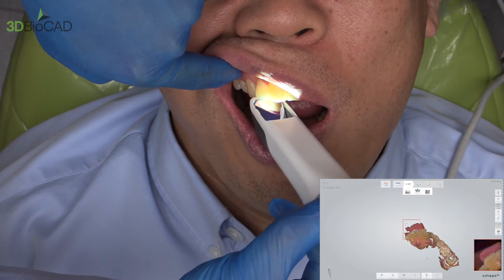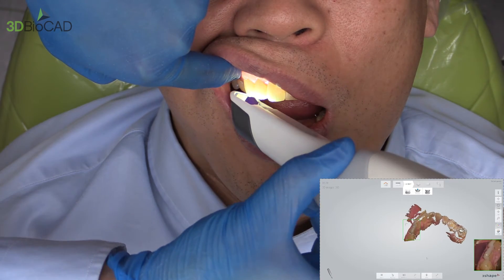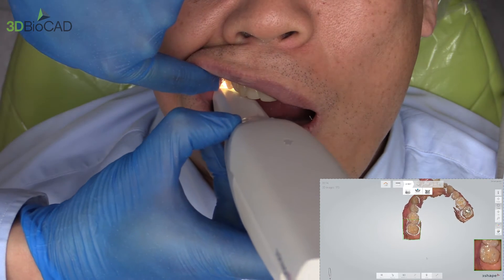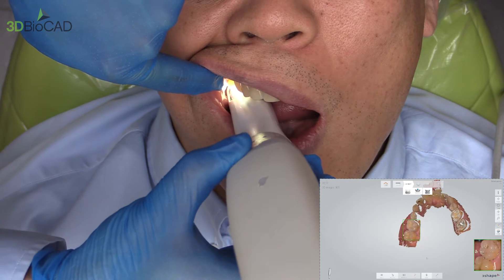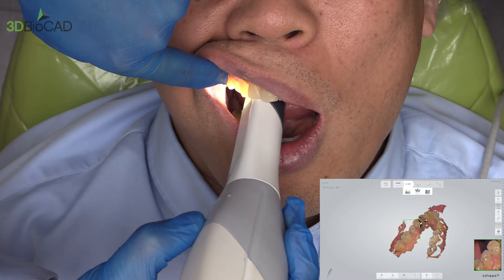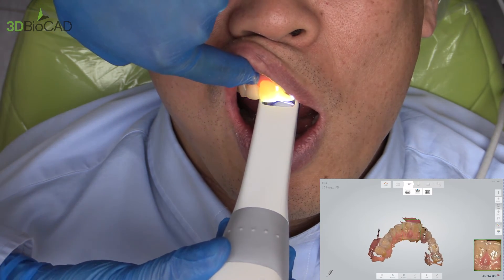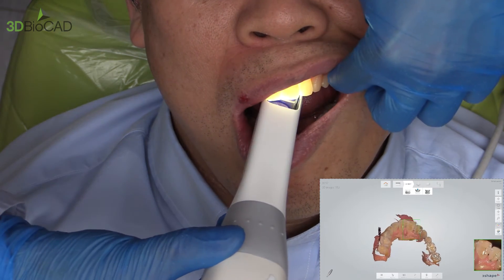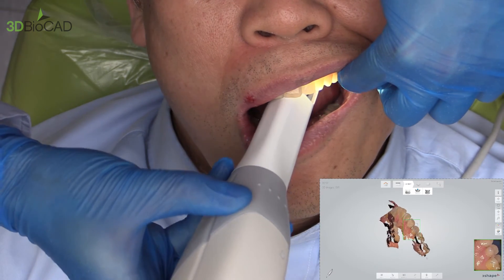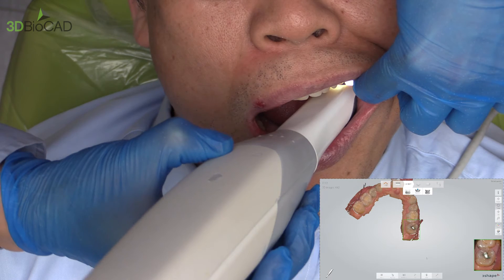Make sure here you want to scan a little bit of facial, just giving the computer a reference to put pictures together when you're scanning the facial later on. Rotate to the lingual side. I look in the patient's mouth and I try to listen to the sound. As you get better with the scanning procedure, it's like driving — the road is your main thing to look at, but sometimes the screen on the computer can be your side mirror.